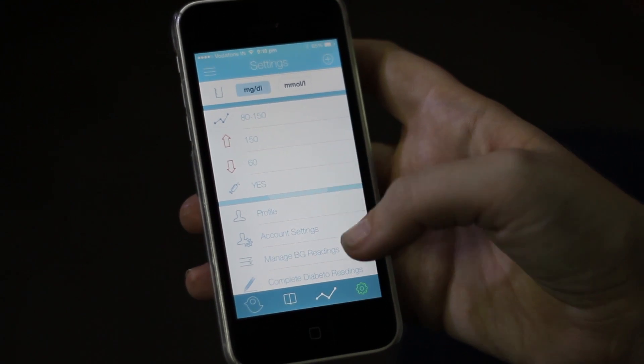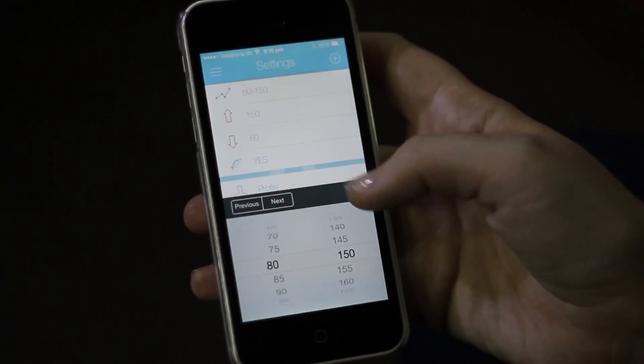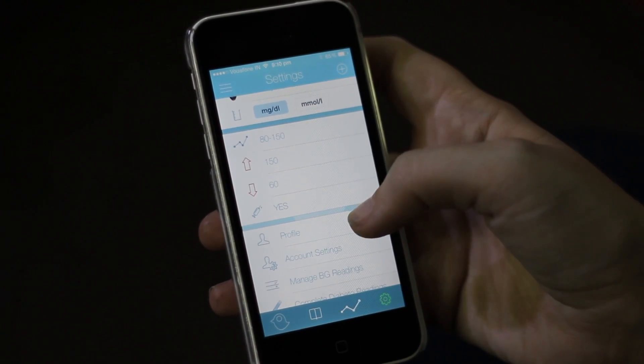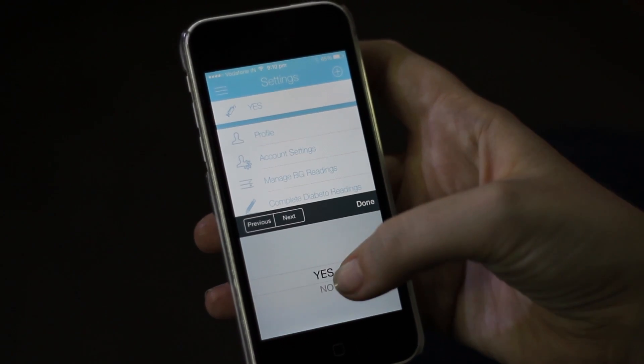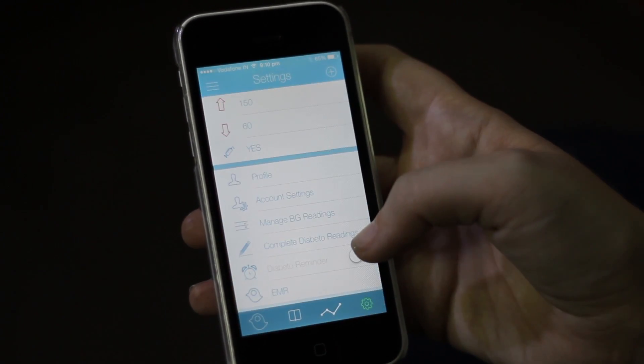The next thing you need to do is make sure you put in your high and low range. For me it's 80 to 150, my high is 150, my low is 60. You also need to make sure that you change whether you are taking insulin or not. Since I'm type 1, I'm going to put yes.